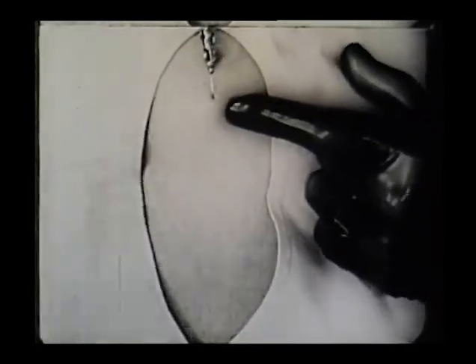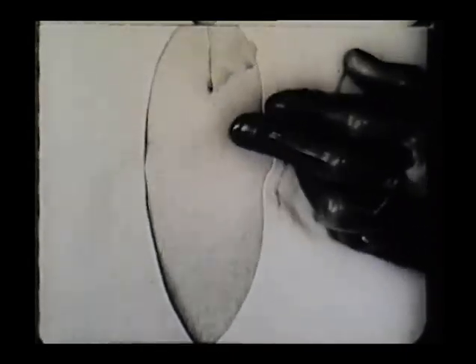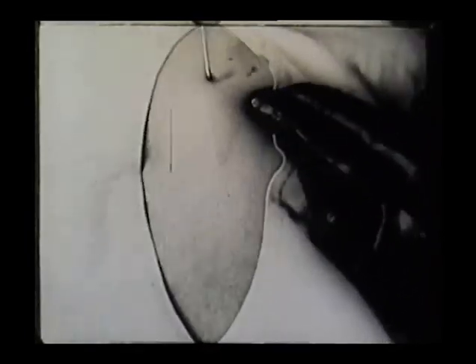Navel. We use a very fine needle to make a wheal in the skin. Then the big needle doesn't hurt when it goes in. Inject the Novocaine into the skin itself, and, of course, into the fascia right under the skin.